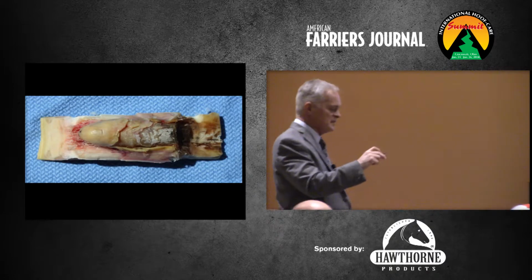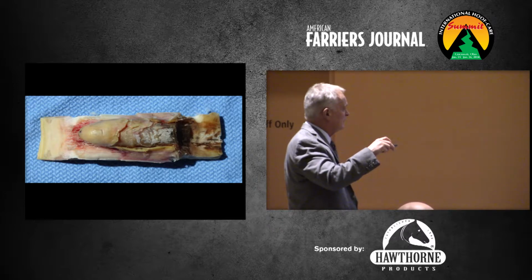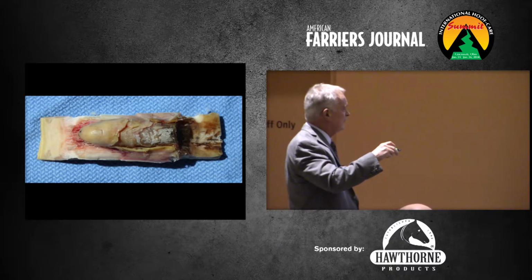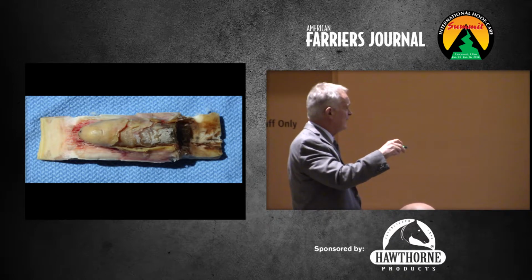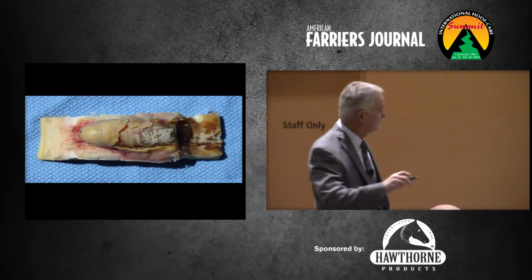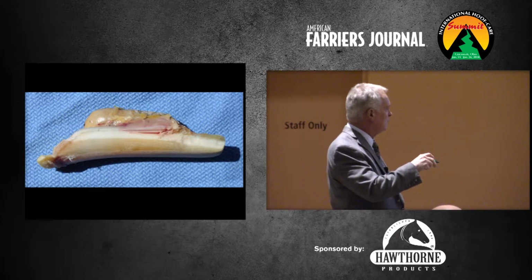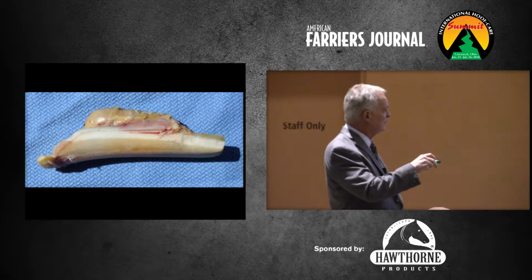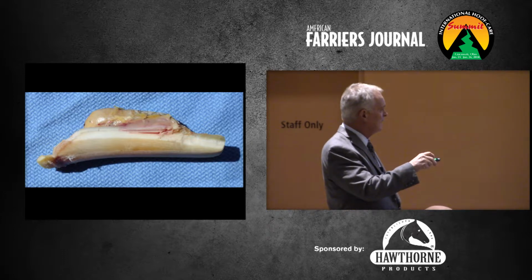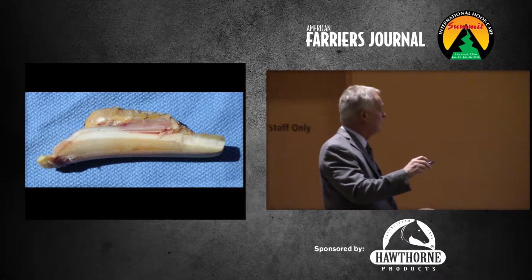So this is that horse's keratoma. This would be up at the coronet. This is hoof wall. That's the bottom surface that we were looking at. Here's our epidermal lamellae, and then there's the big mass of keratin that's on the inside of the hoof wall. Okay, this is looking at it from the side. So outer hoof wall, coronet up here, ground surface. Here's our pigmented stratum medium, non-pigmented, and there's that big mass that shouldn't be there.